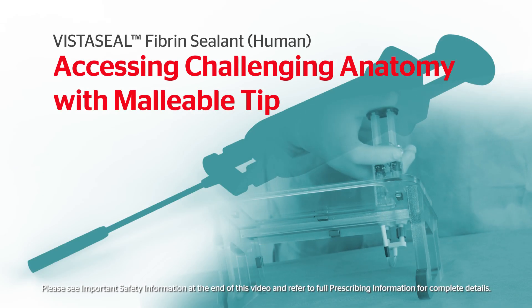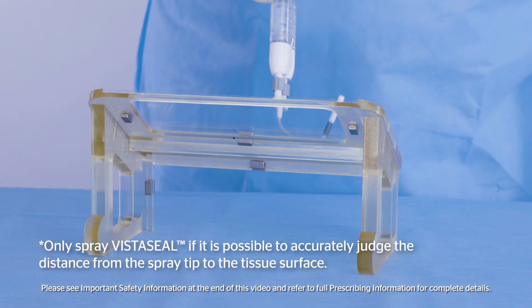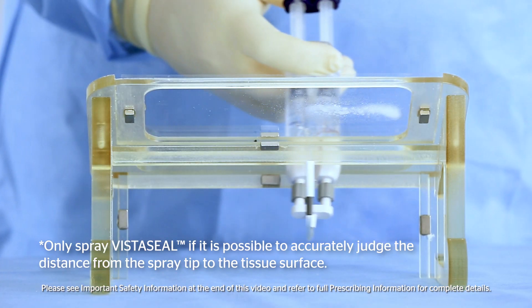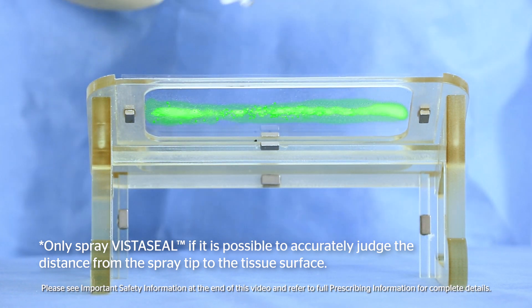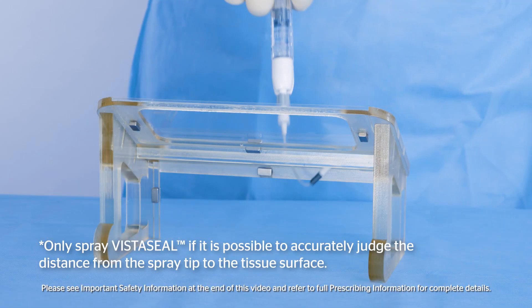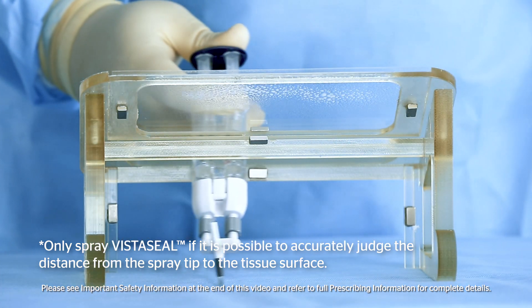The malleable tip provides precise application to challenging anatomy. This shows the malleable tip being used in a narrow spray method. This shows the malleable tip being used in a broad spray method.